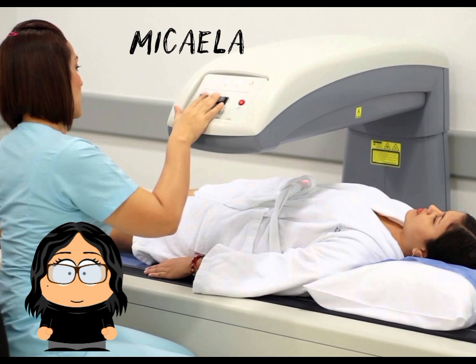How is it performed? The test requires no special preparation, is painless, and has no side effects. The patient lies on the table while an X-ray generator slowly passes over the area to examine, usually the hip or spine. The test lasts approximately 15 to 30 minutes, and the patient can resume normal activities immediately afterward.